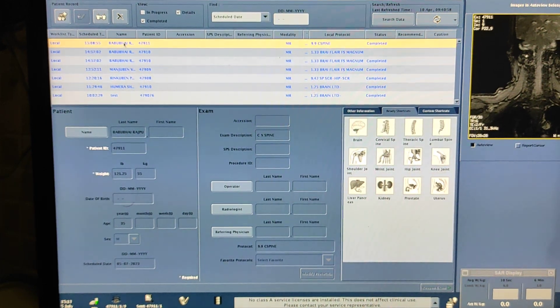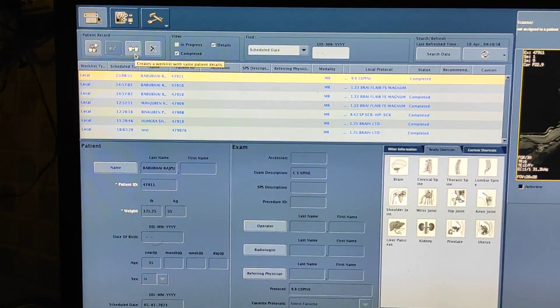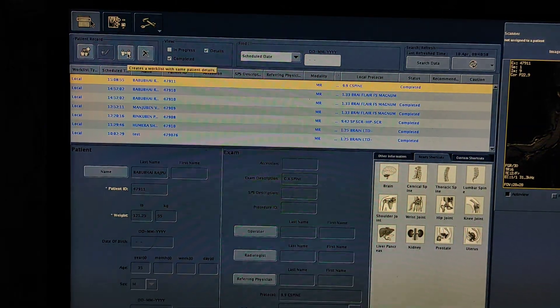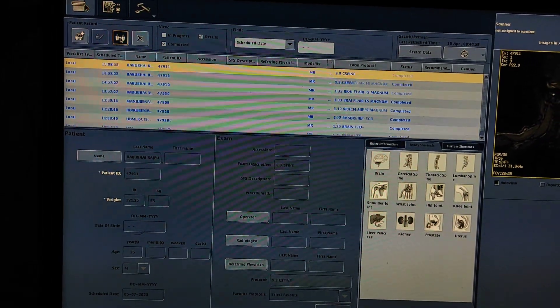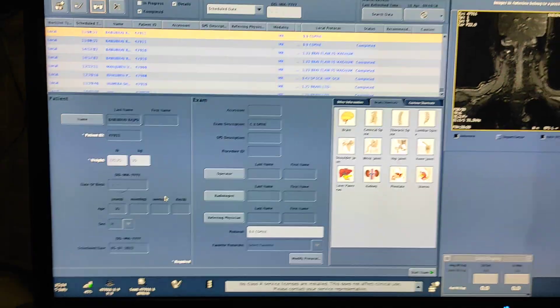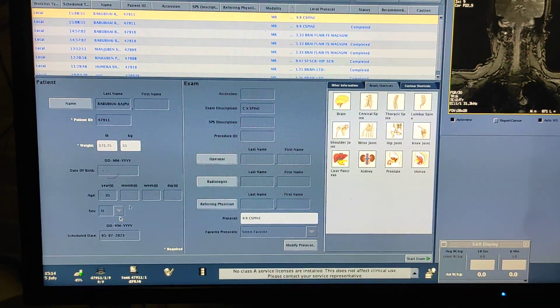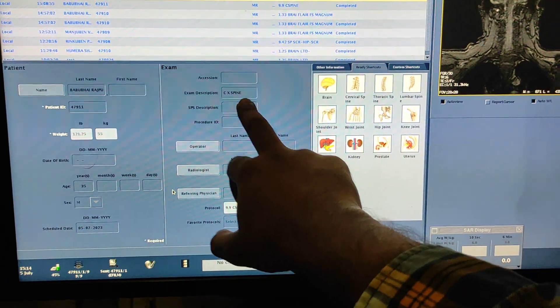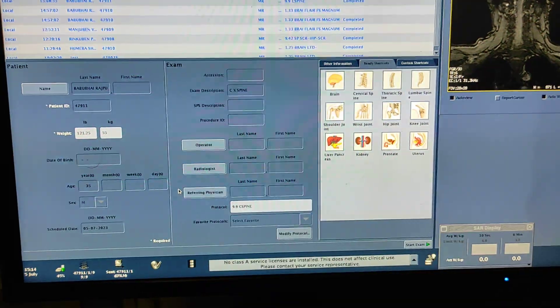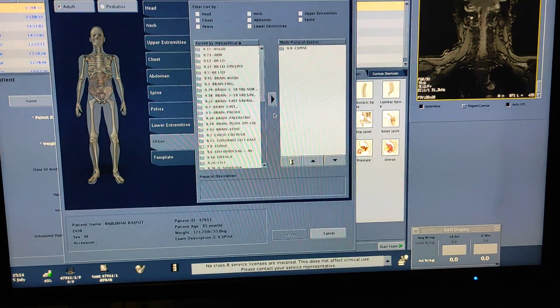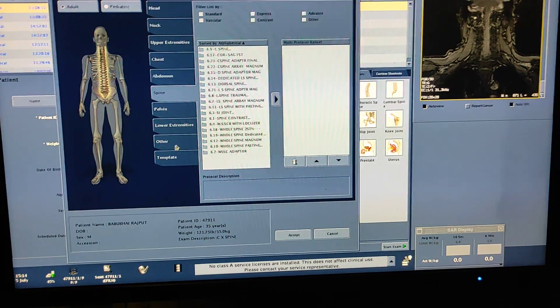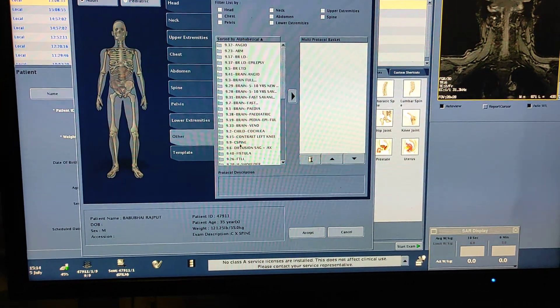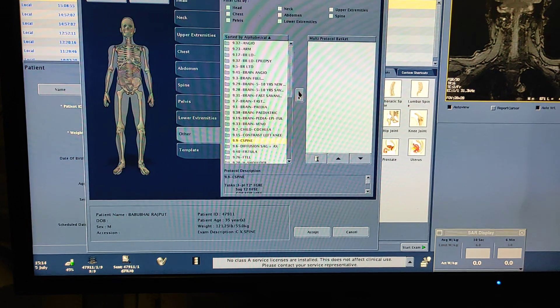Click on the patient name — from here you can copy a sequence. This option is 'Create a Work List with same patient detail.' Click on this. Now we are on the entry desk. Enter patient description; exam description is 'Cervical Spine.' From here you have to select the protocol. Ideally protocols of spines are in the spine region, but I have kept my protocol in 'Others.' Select the cervical spine protocol and press Enter.